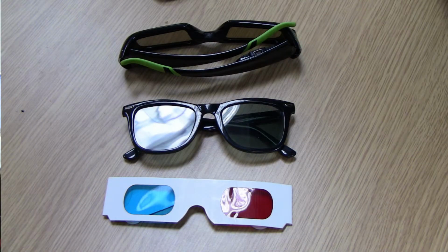when operators use 3D visualization. 3D visualization is much better than 2D visualization, interestingly, regardless of the technology. So even if you use a very cheap and limited approach to 3D visualization, the performance is still very good. Also, we noticed big variation in performance with different systems, which we also reported. And we think all these results are very relevant for system designers to make informed decisions.